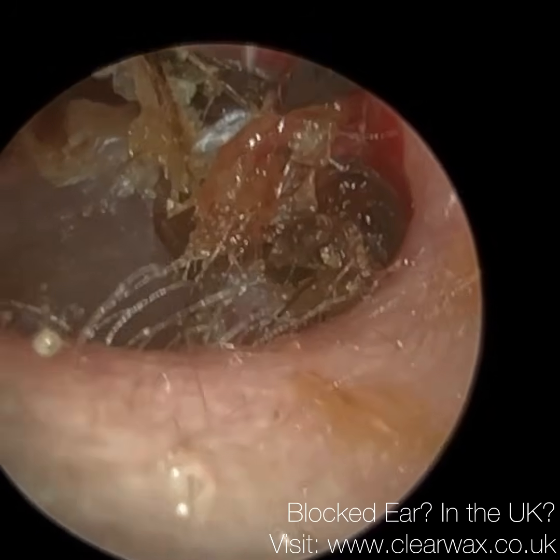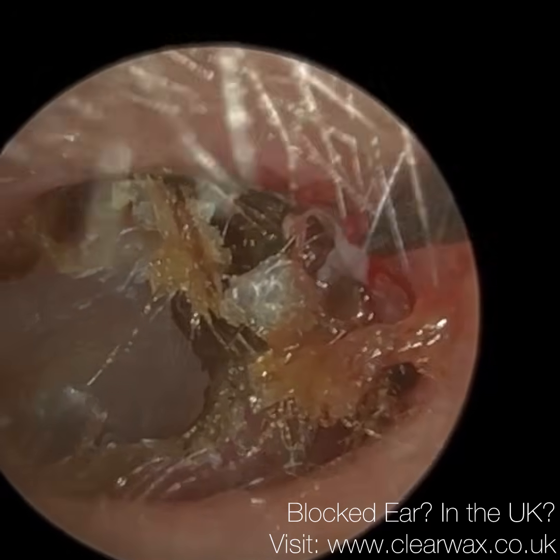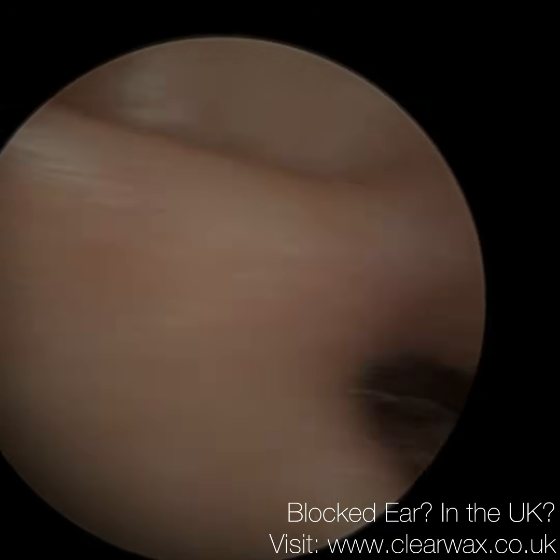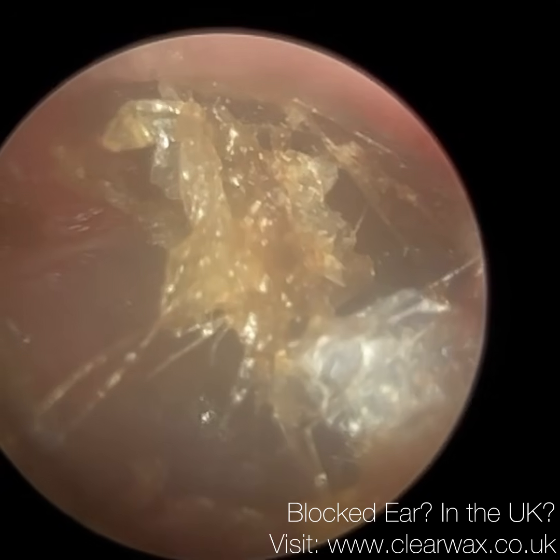So what we're doing here, I'm just trying to lift this from the floor of the ear canal. I'm using various instruments. I'm using the ear pick here. I've used the ear hook, and forceps and suction now. There's some bleeding there, but that's not because we've scratched the ear canal. There's just some granulation tissue formed.